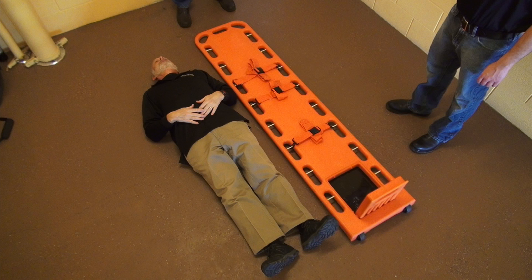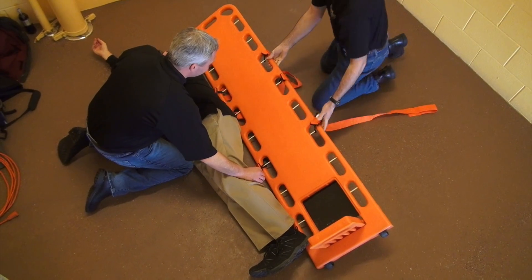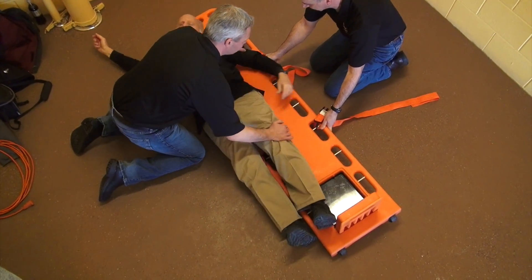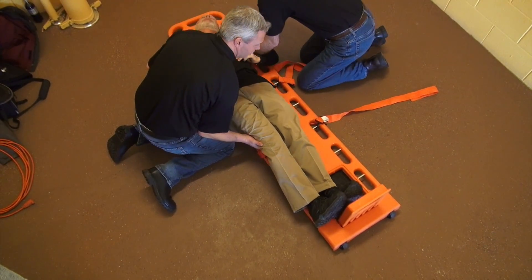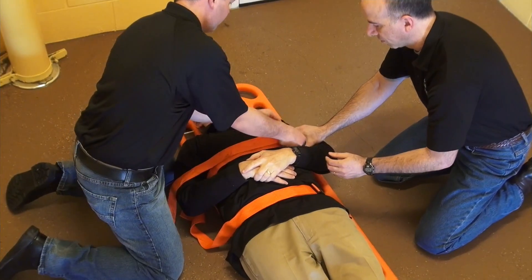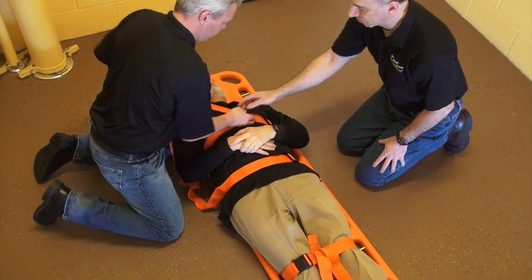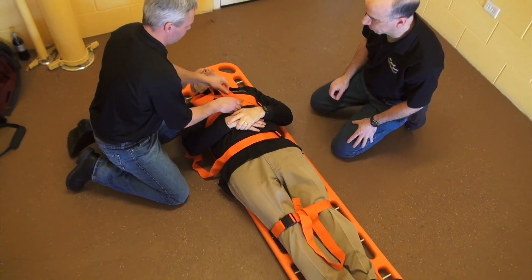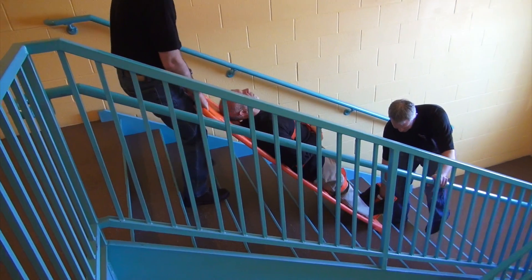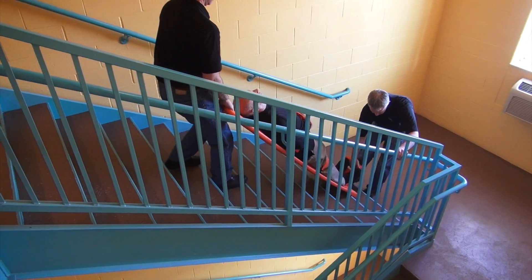Place your walkboard next to the patient. Log roll the patient onto the walkboard and secure the patient to the walkboard with straps at the knees, waist, and upper chest. Securing the patient at the knees, waist, and upper chest will maximize the patient's stability during transport.